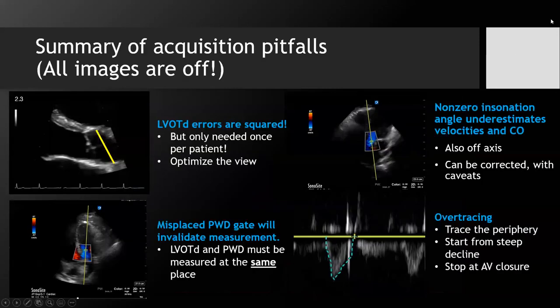So what Cyrus is referring to is something I said I might mention, which is here. When you have color Doppler, this shows up on your screen and tells you that it's measuring 67 centimeters per second. If it's going towards you, it'll be red. If it's going away from you, it'll be blue. If it's beyond that, it circles around in what's called aliasing and changes the color. That's why when you have turbulent flow and it goes to 70 or more centimeters per second, you start getting all these different colors. Depending on the physics of the machine and how deep you are, you could adjust this to optimize for higher or lower velocities. These are optimized for 67, which is generally the speeds we're dealing with.